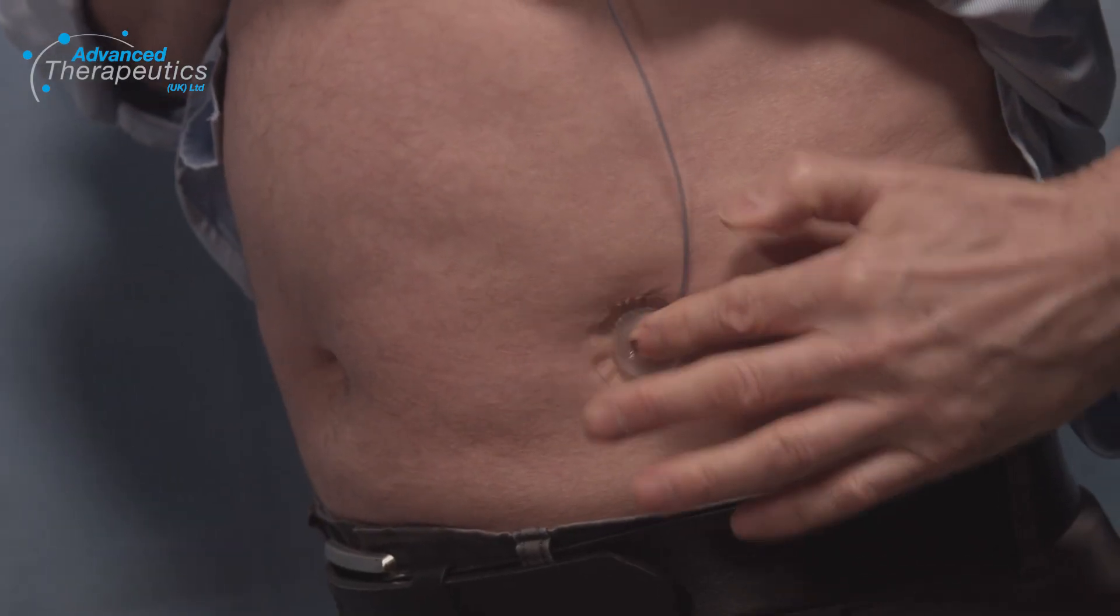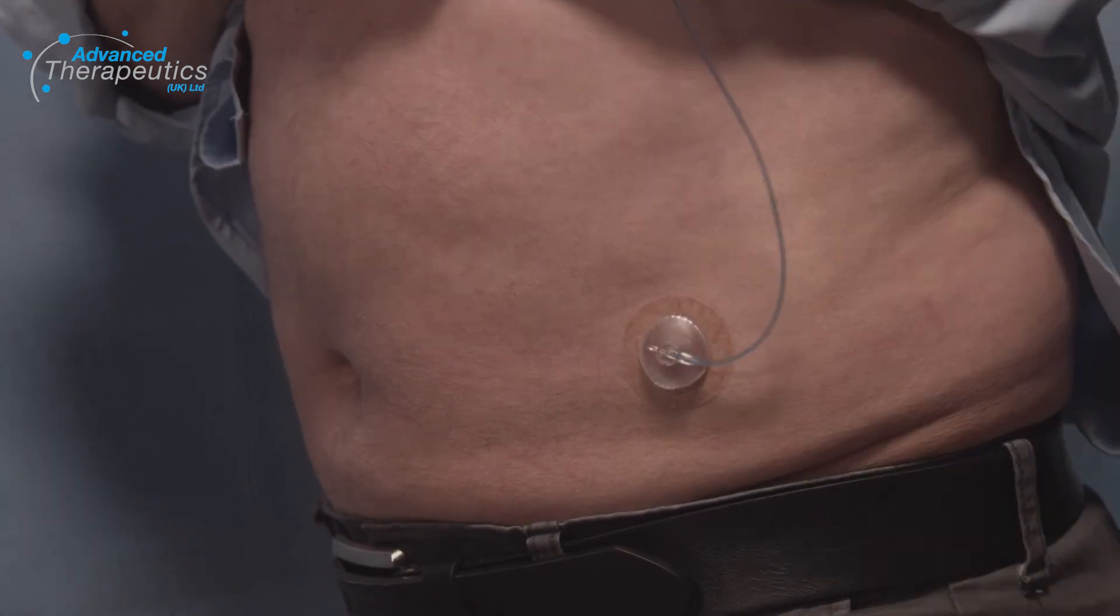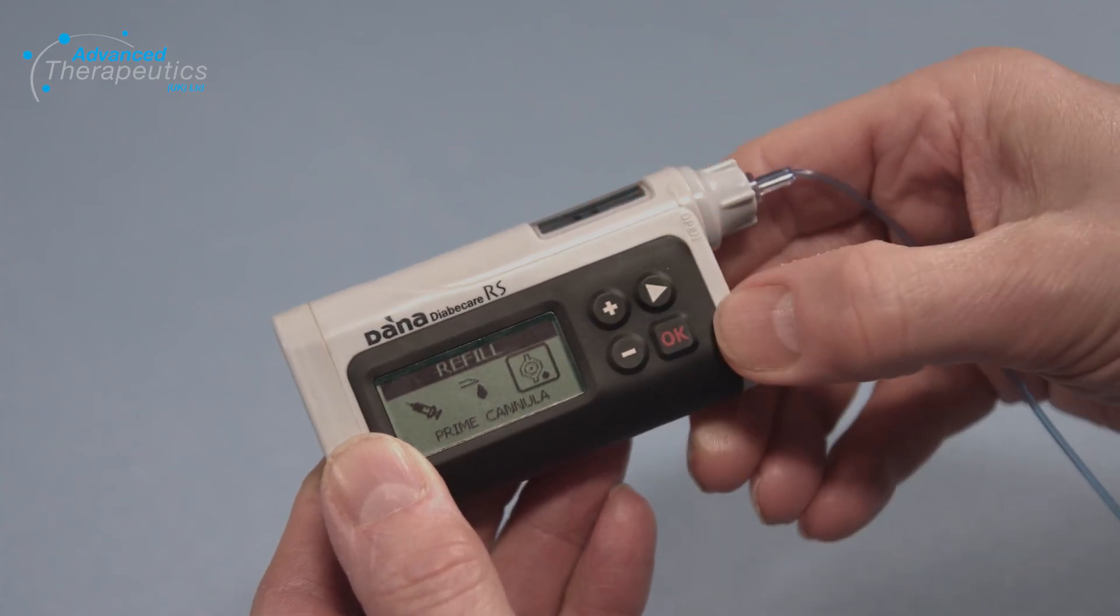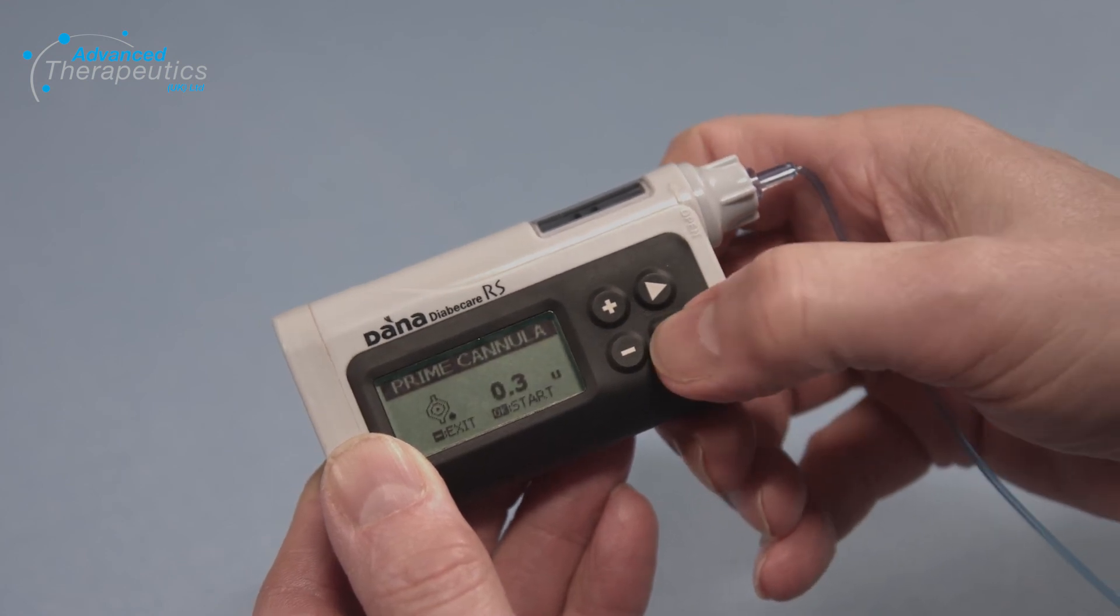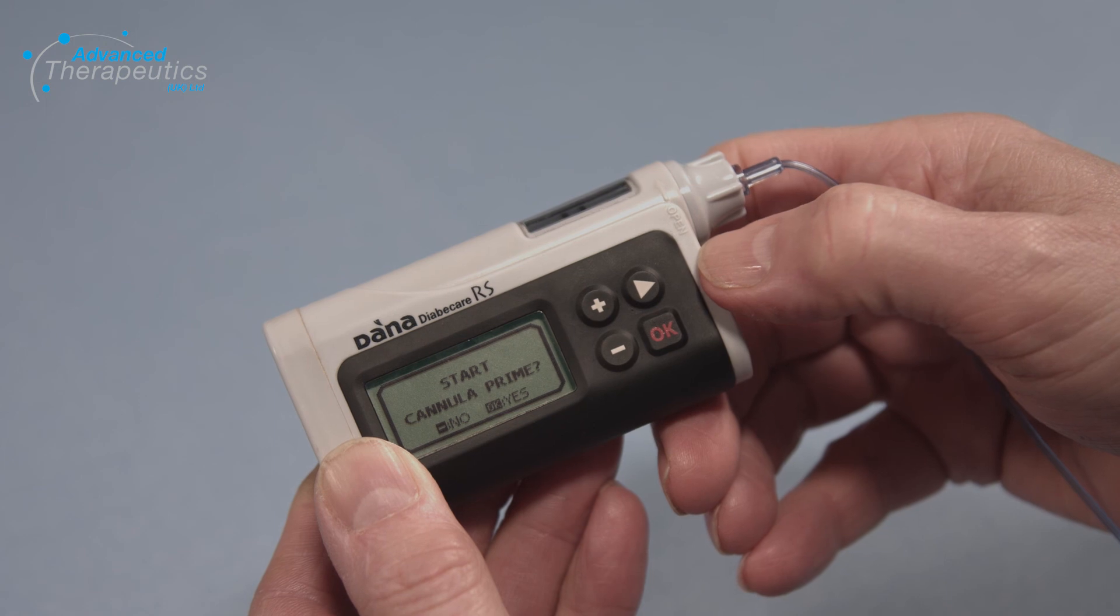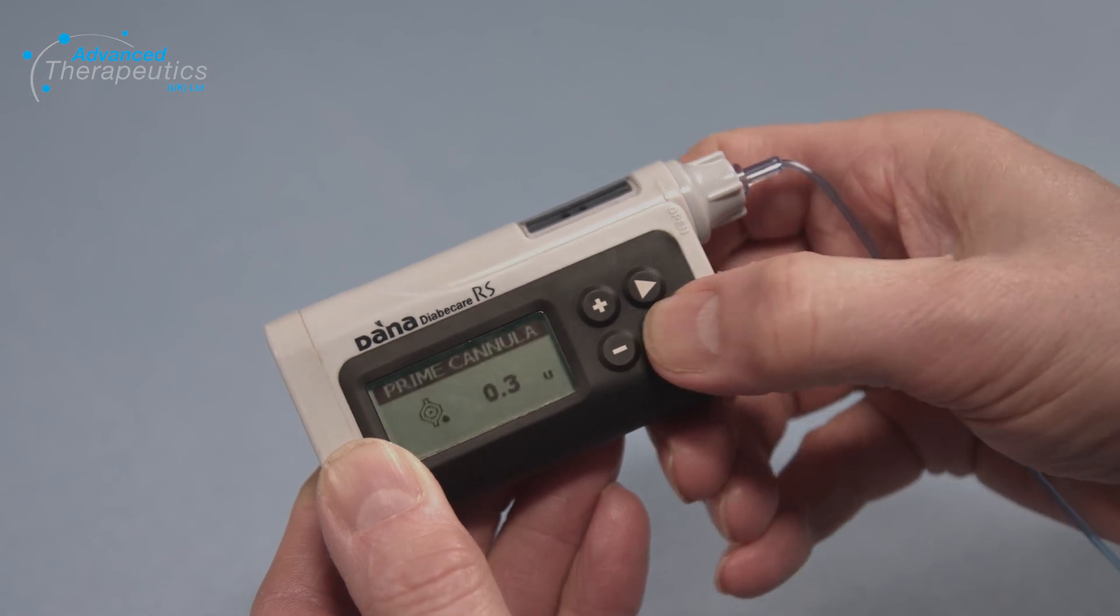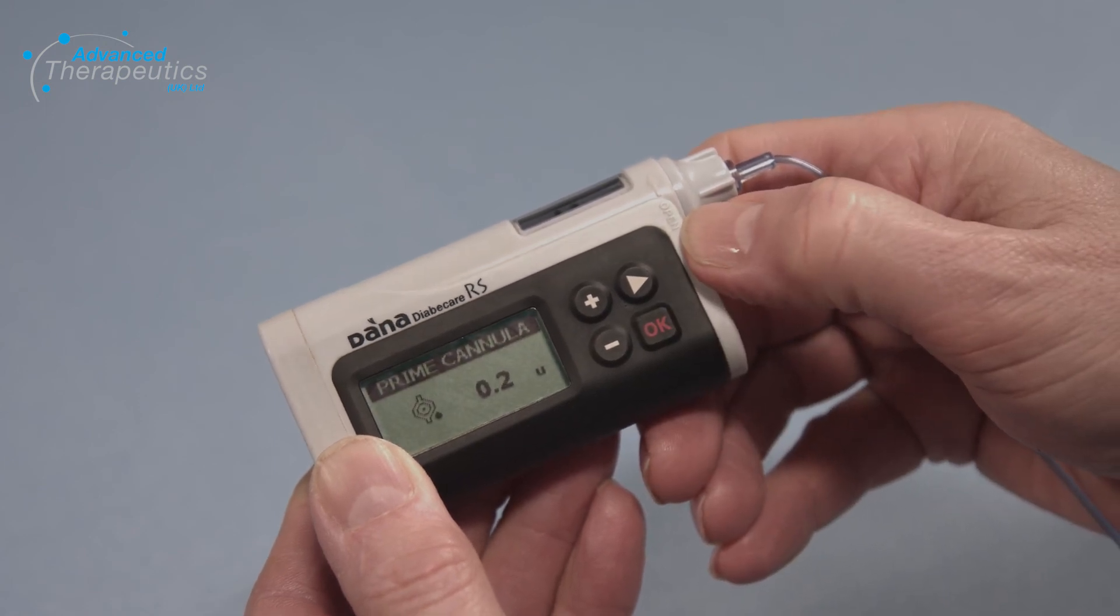Connect the tubing to the inserted cannula. Press the arrow to move to prime cannula, press OK and you will see the prime volume, 0.3 units for a 6mm cannula. Press OK and then OK again to prime. The pump is now ready.